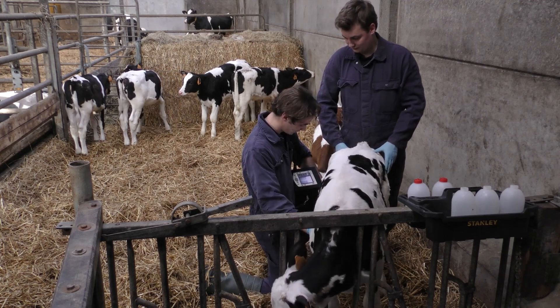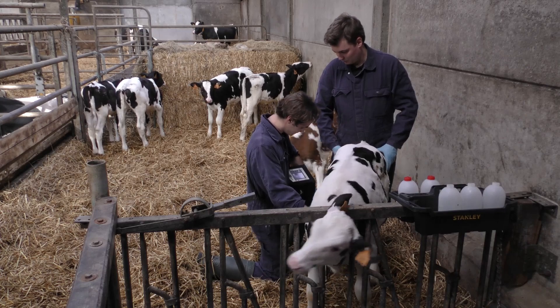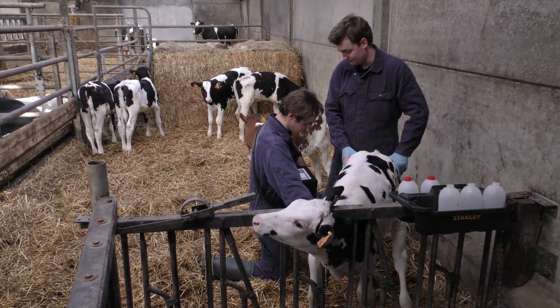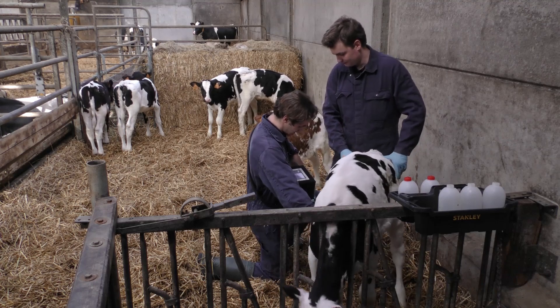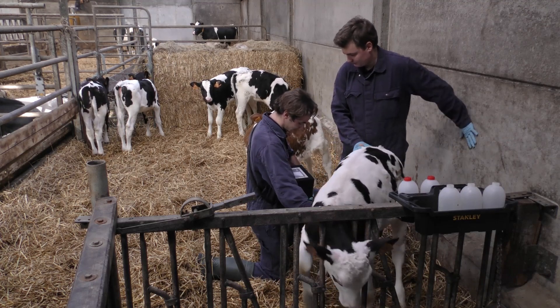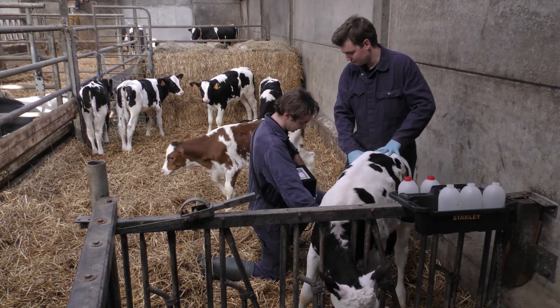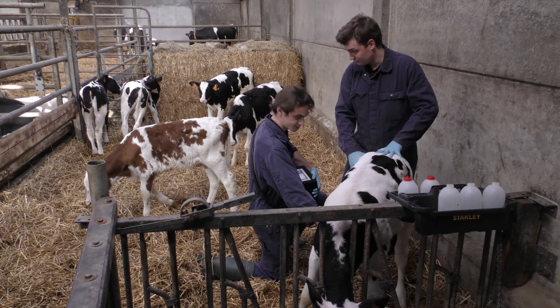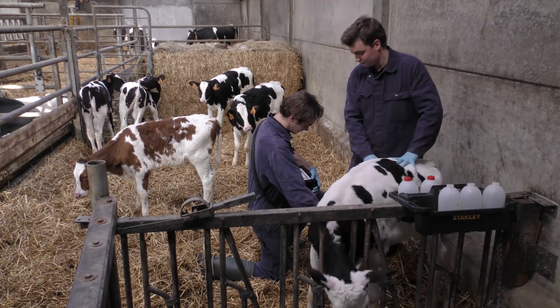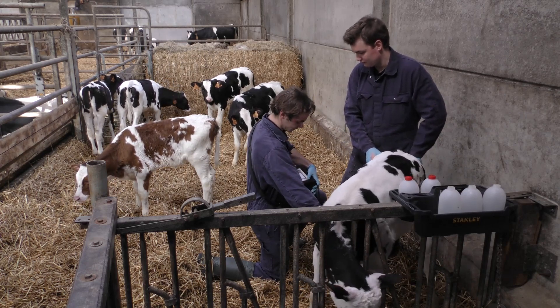Wanneer we dan verder gaan naar voren, komen we aan het hart. Dan brengen we mooi het hart en de long in beeld. En vanaf het hart duwen we eigenlijk nog naar voren om ook de voorste longkwabben in beeld te brengen. Op de voorste longkwabben zien we een onregelmatigheid van de pleurale lijn, dus van het longoppervlak, zonder dat hier effectief ernstige letsels wijzend op bacteriële pneumonie aanwezig zijn. Wanneer we het eindpunt in beeld gebracht hebben, hebben we eigenlijk het volledige longoppervlak gescand.